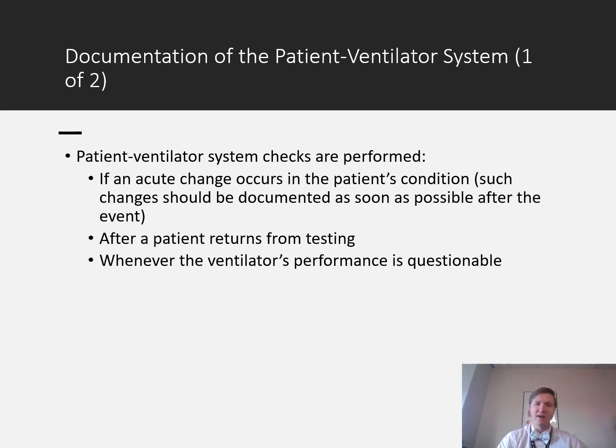And then whenever the ventilator's performance is questionable, once again, are you concerned that you have odd alarms going off? Are you concerned that you don't have as good chest rise? Go ahead and do a vent assessment. See where you're at, because it's a way to check and look at some of the different systems that are going on and how the patient's interacting. You might be able to check something pretty early on and find it and fix it pretty early.